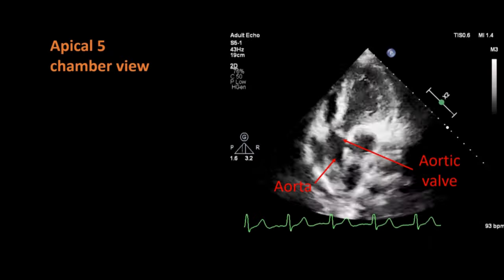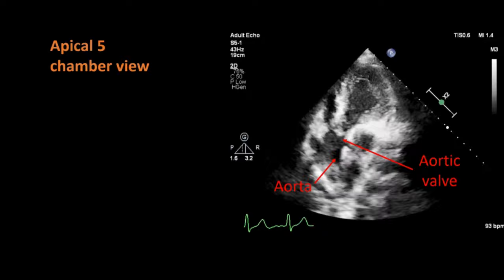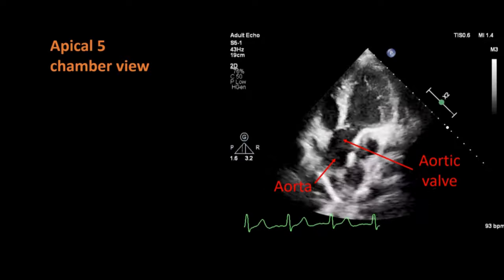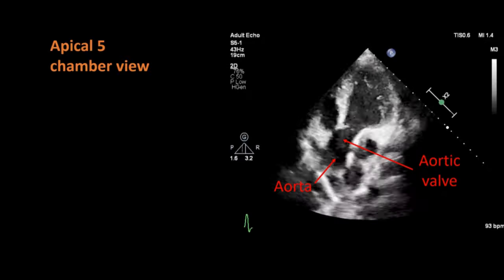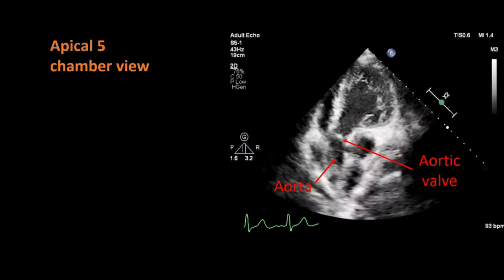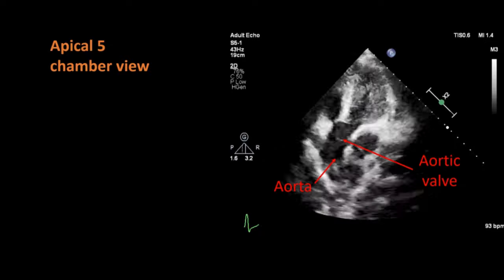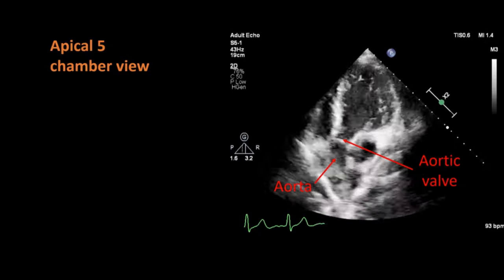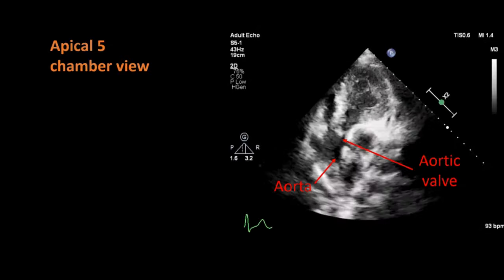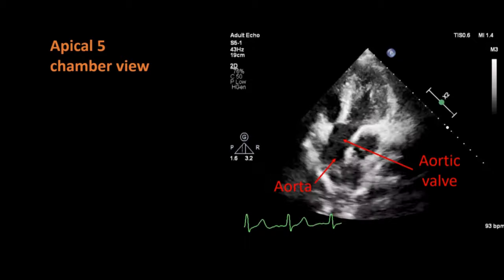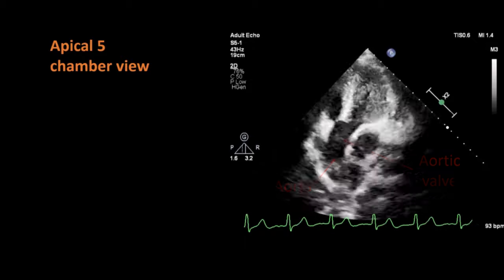We can calculate the systolic pressure gradient across the aortic valve with the help of continuous wave Doppler for aortic stenosis. And with the help of color Doppler, we can see the regurgitant jet towards the left ventricle in cases of aortic regurgitation.